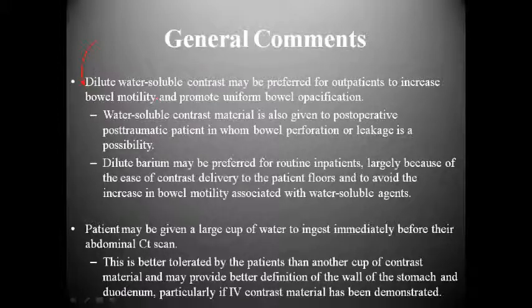There was no abnormality, nothing. And so we decided that we were going to do IV and oral contrast. And so we had both barium and water soluble. However, because this is an ER patient, our protocol is that we use dilute water soluble contrast. And typically that's what we utilize for probably the high majority of our patients. And so I gave this lady some water soluble contrast to drink.